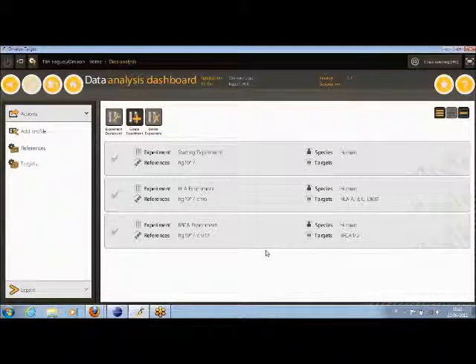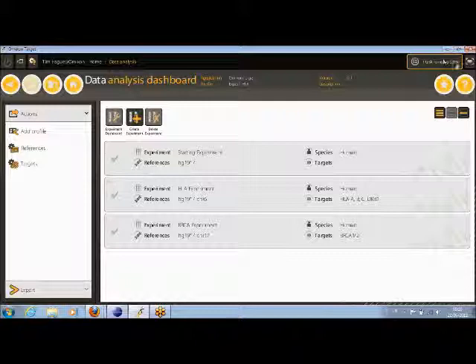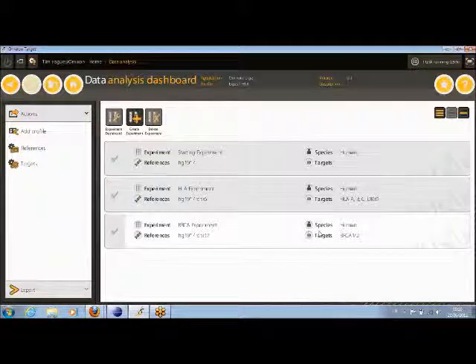Normally this will download this file automatically via the internet, and install it into the tool without any other intervention. So this is running a little background task. You can see the status is running over here. It only takes a few seconds to add a new profile. I'm just going to wait for that to finish. There we go, it's finished.